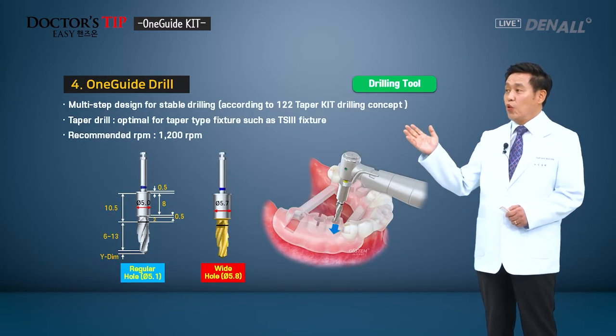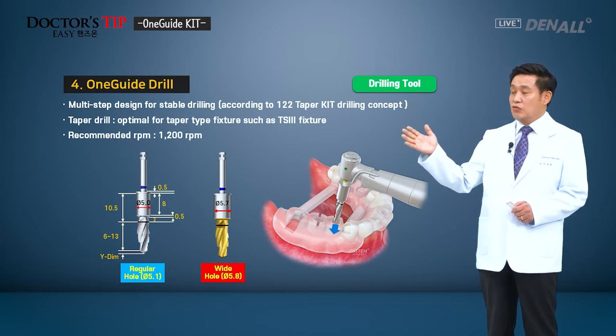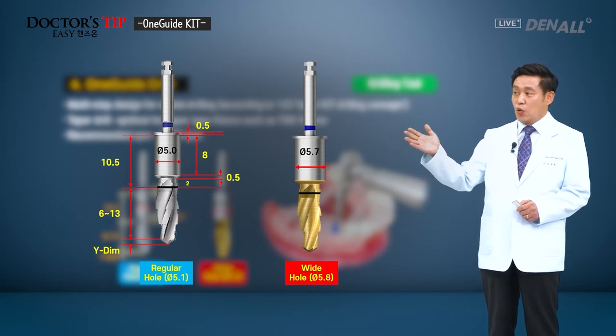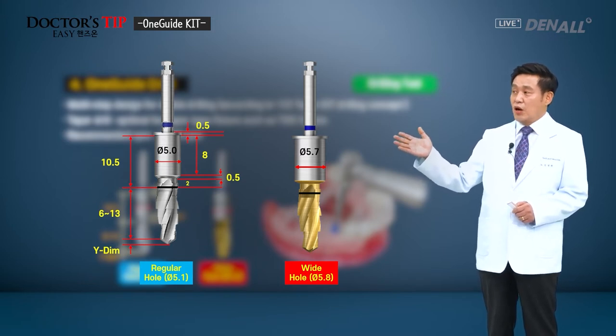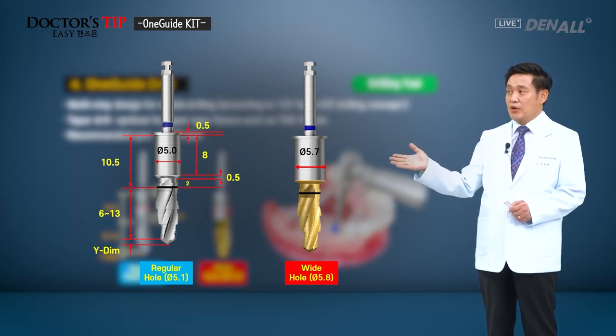The next is the most important one, the OneGuide drill. The OneGuide drill, as shown, is like this. For a regular 5.1 diameter hole, you can use a OneGuide drill with a 5.0 barrel, a 0.1 difference. And for a 5.8 diameter hole, you can use a 5.7 mm barrel drill. The difference is the same.